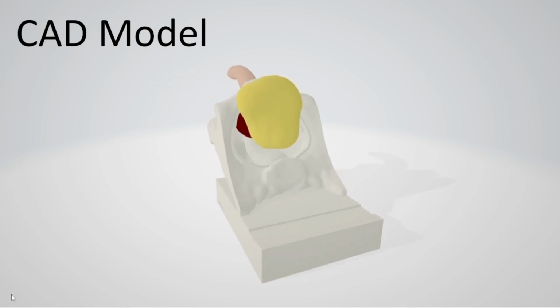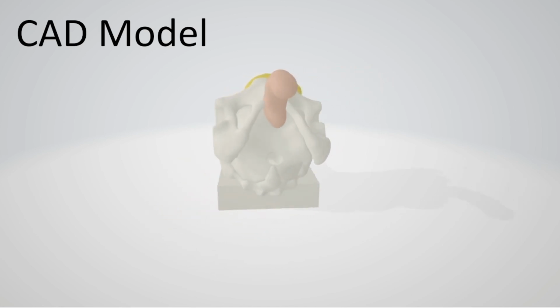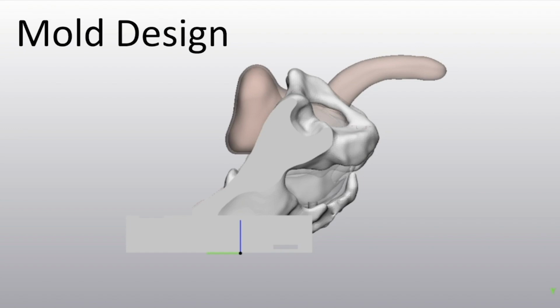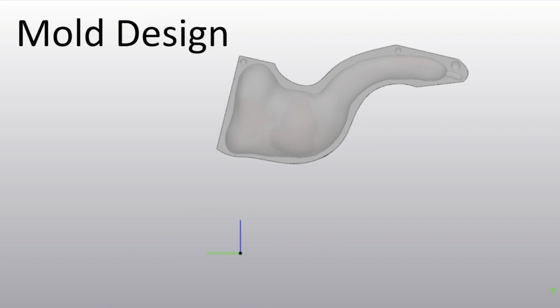It features a penis, prostate, and hollow bladder assembly, a pelvic floor with a section of rectum, and a section of pelvis that forms the boundaries for scope movement. The frame is able to be anchored to the table or bench to prevent movement during simulation. The two-part hydrogel assembly mold was designed to include the penis, prostate, and bladder in one continuous, watertight piece to accurately simulate irrigation and suction through the scope.